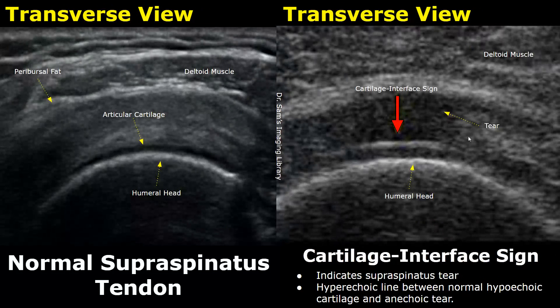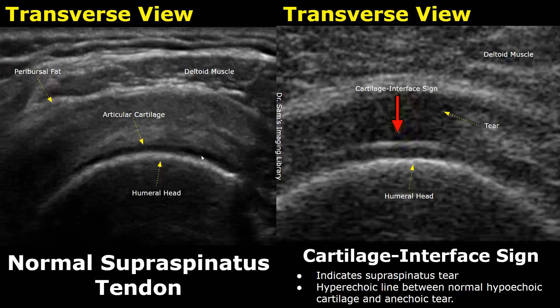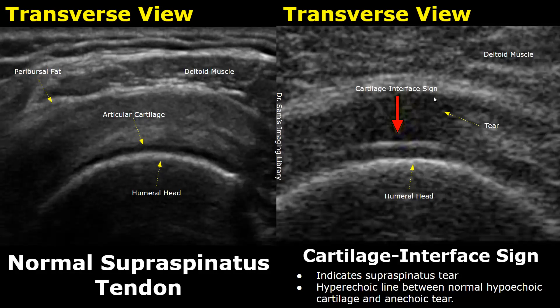A cartilage interface sign can sometimes occur in a supraspinatus tear. Normally we see the hypoechoic articular cartilage in the usual manner, but when there is a tear, the interface between the normal cartilage and the tear becomes hyperechoic due to enhancement from the adjacent tear. This forms a hyperechoic line between the tear and the normal hypoechoic cartilage, and can indicate a supraspinatus tear when seen.